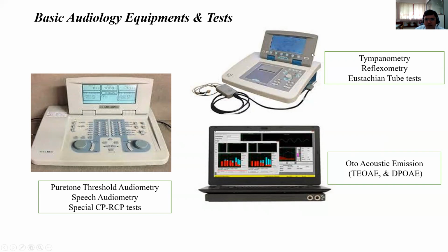In addition to that, this particular equipment is a diagnostic middle ear analyzer, which is used for obtaining tympanometry, reflexometry, and some of the special tests like Eustachian tube function test, electrical SRT test, ESRT, as well as reflex decay test. These special tests also help to differentiate cochlear pathology from retrocochlear pathology.